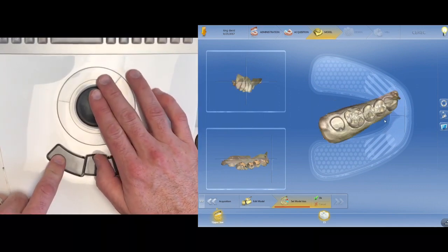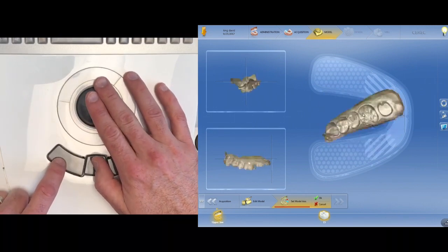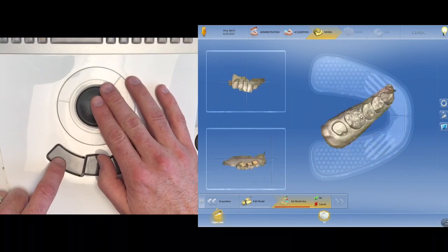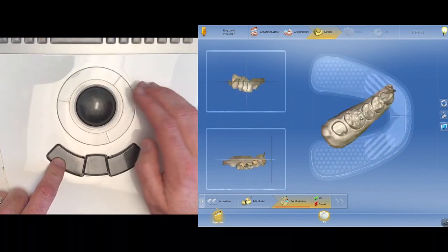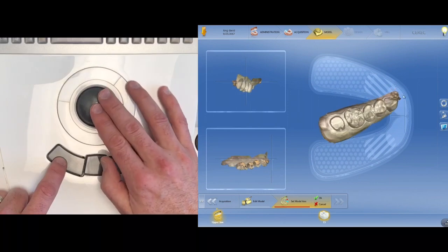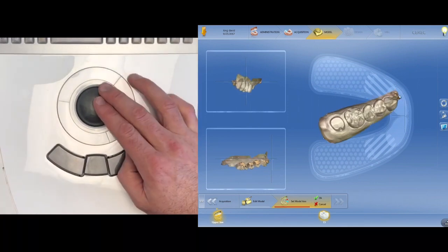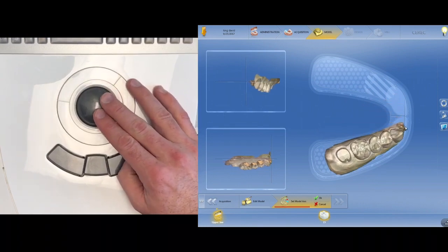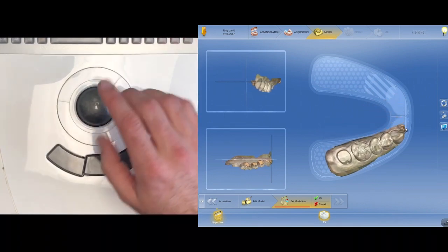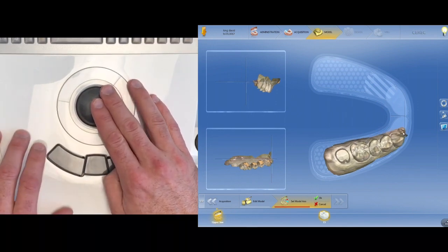But we can rotate. And as I said before, you don't want to grab right in the center because it's really hard to control when you grab right at the center of the model when you're using this particular screen. So grab off of the model. It gives you a lot finer control. Let's position it first. I'm going to use my pan to pan the image to where I want it to be. I'm looking at the right side now over here. Pan it to where I want to be.